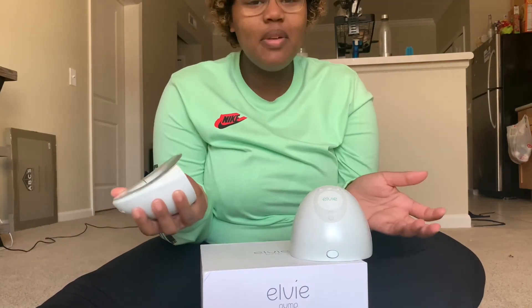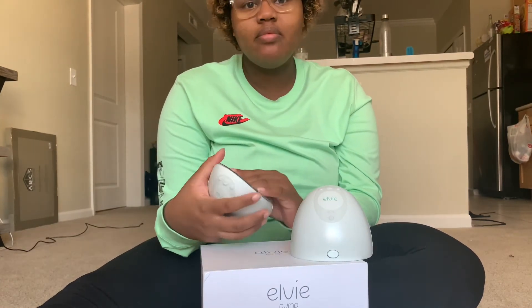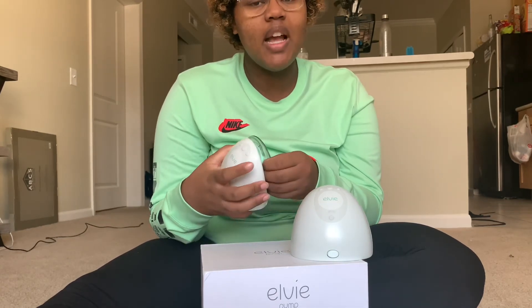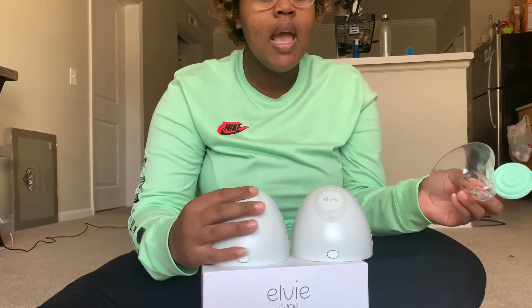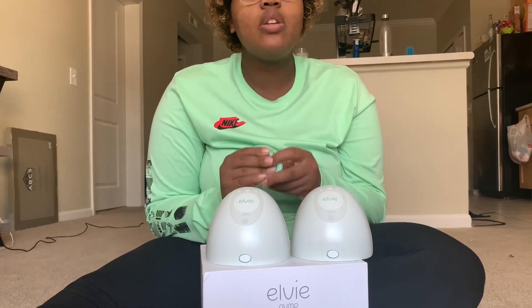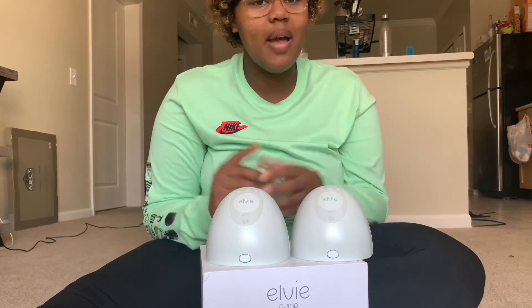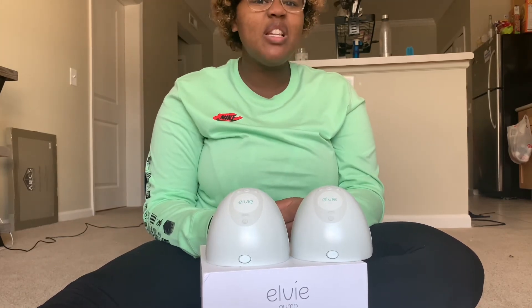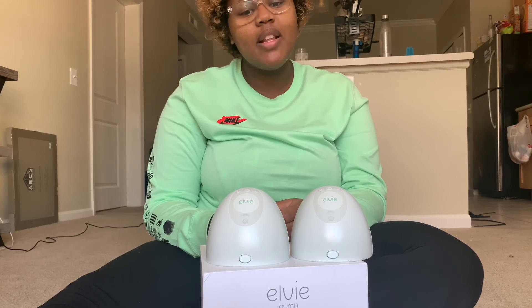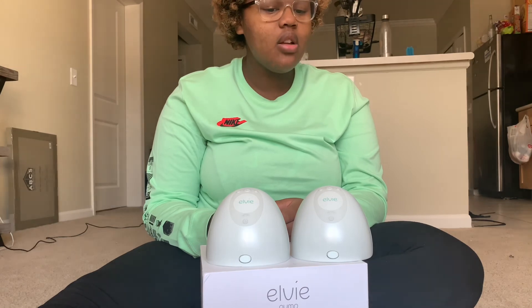I would just say save your money, don't buy this pump. There are so many more options out there that are not this expensive and could be even more convenient. A great way to make the pump you already have portable is to get a battery pack and just plug your existing pump into it — I would definitely recommend doing that instead of spending $500. It just isn't worth it.